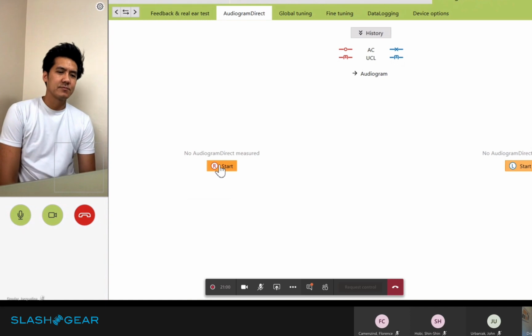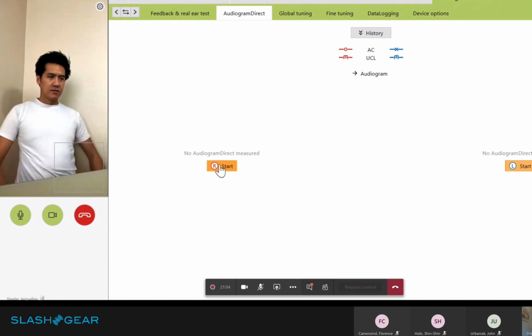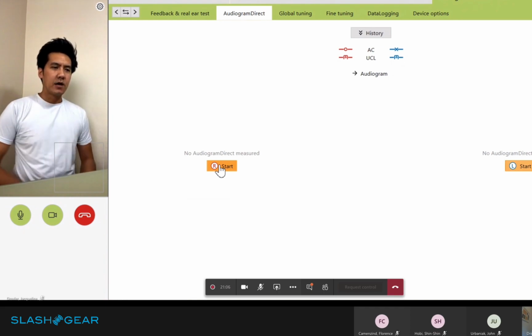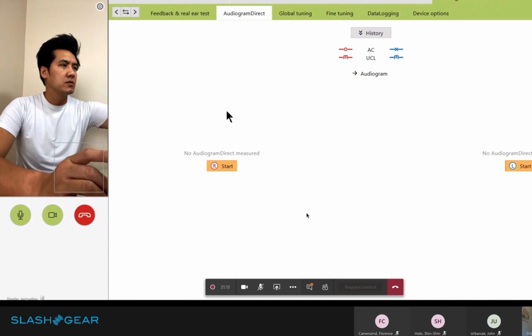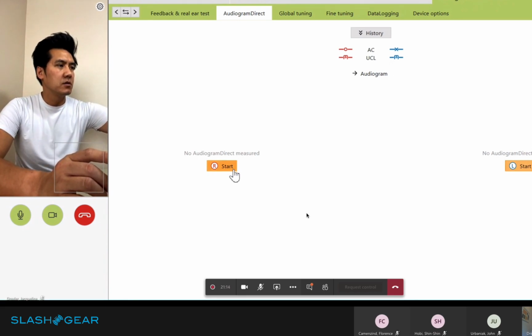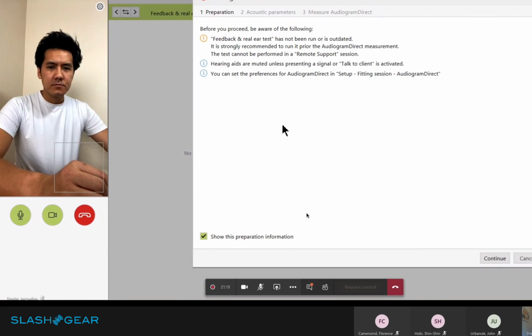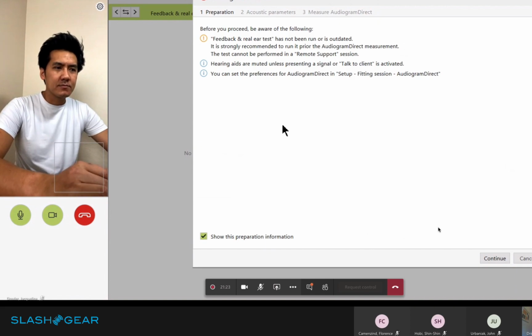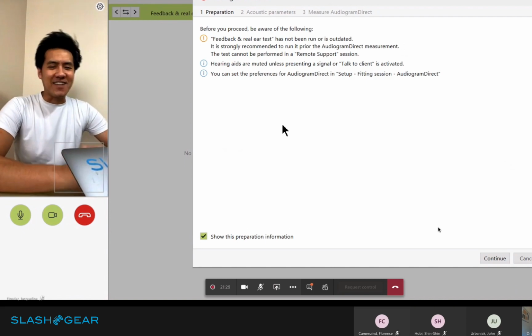So that way, when you're listening to the beeps, how do I let you know which side I'm hearing? So you're going to look at the phone, and I'll give you instructions. Okay. And actually, with this part, to avoid cheating, try not to look at your computer where your Teams is. Okay. All right, computer's down.